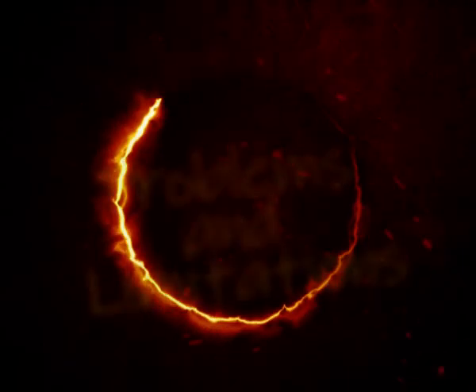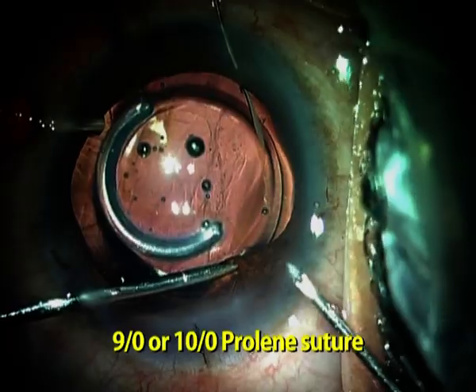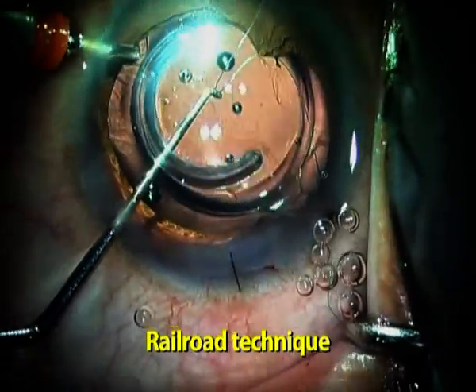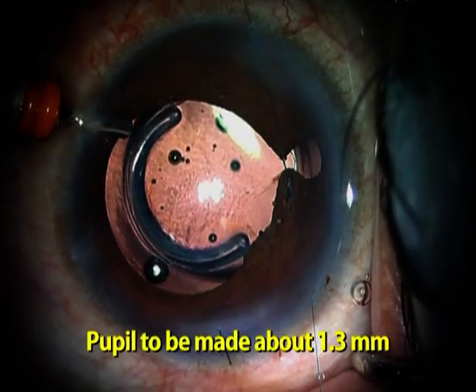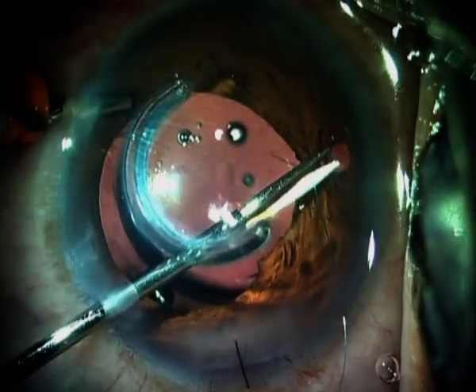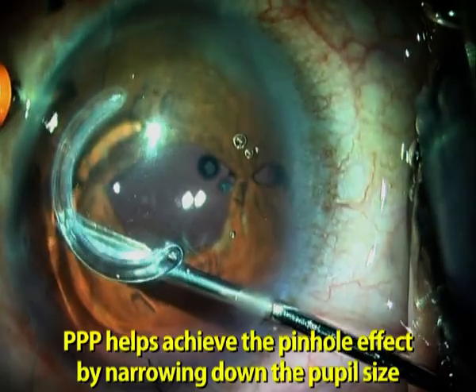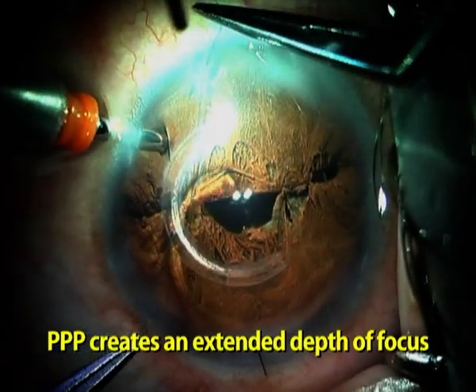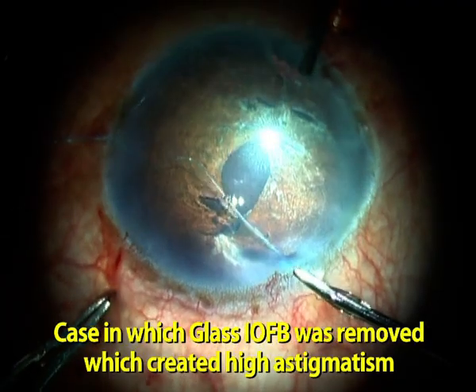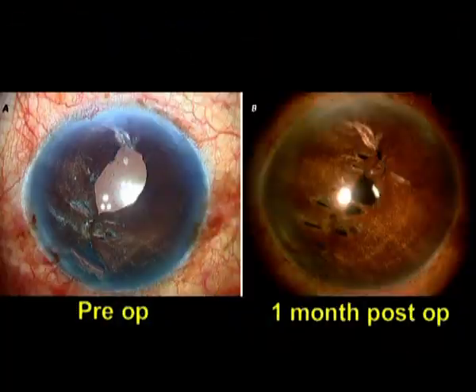A limitation of the procedure could be insufficient iris tissue to perform the pupilloplasty. Another limitation would be to perform this procedure in a phakic eye. A phakic eye should be made pseudophakic as there are high chances of cataract forming during pupilloplasty. Although there are limitations of the procedure, the advantage of being able to focus and achieving an improvement in visual functionality outweighs the shortcomings. For achieving the pinhole effect, surgical pupilloplasty is a cost-effective and efficient method, as no specially designed device is needed for the same.